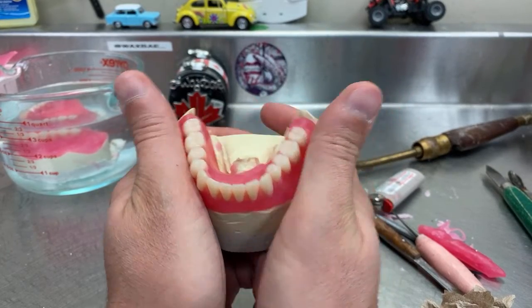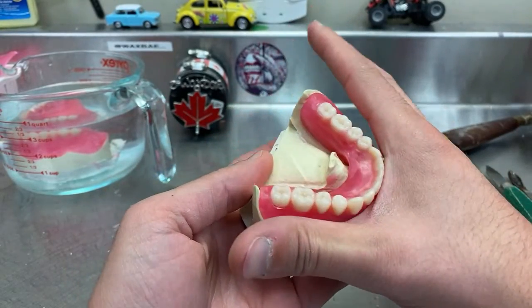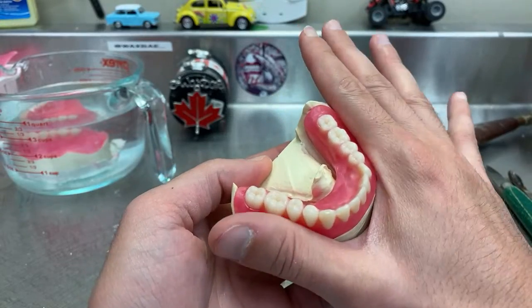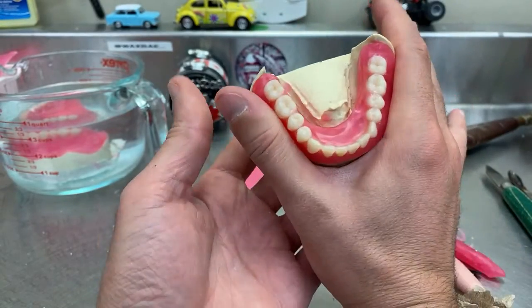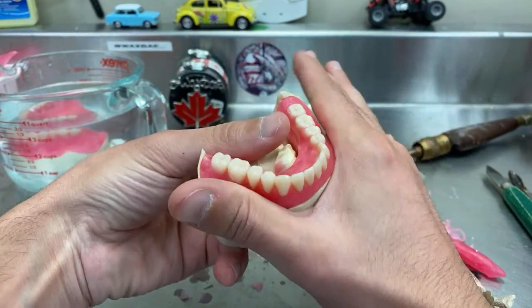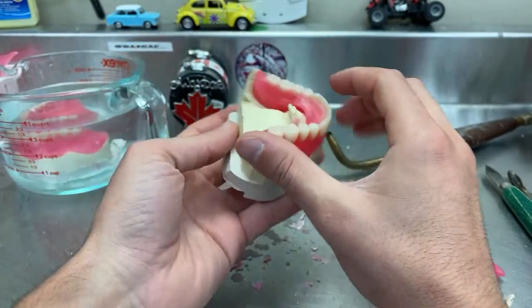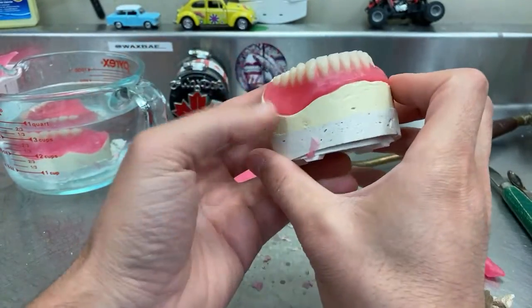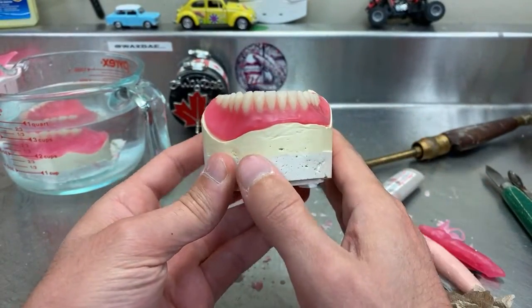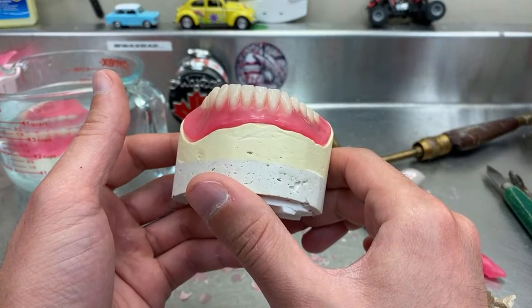I think they're the buccinators, and they'll be sitting here when it's in the mouth. You have two muscles here, very strong, and when you talk they tend to clench here, and your tongue will start moving. And if you're opening your mouth, they will also tighten up a little bit. So to have this, instead of just a flat straight line, it helps with retention. So it's always nice to have it.